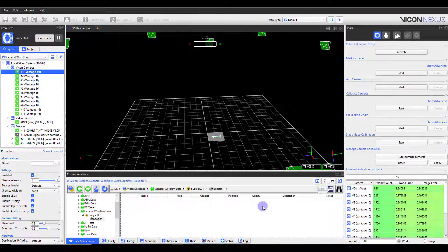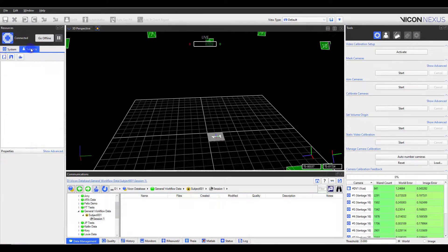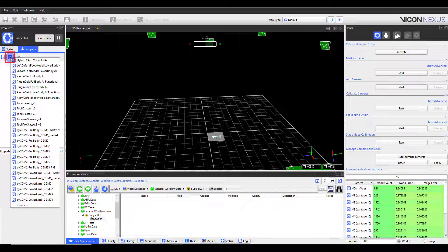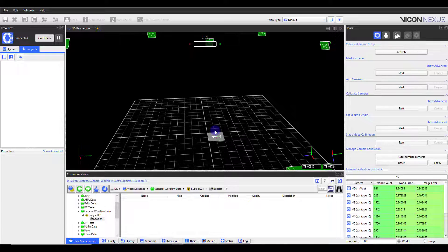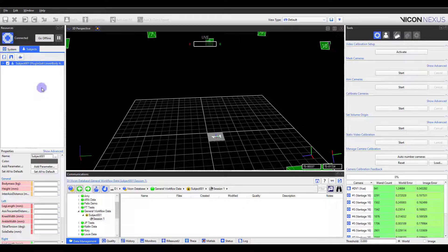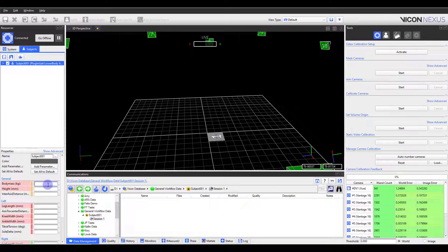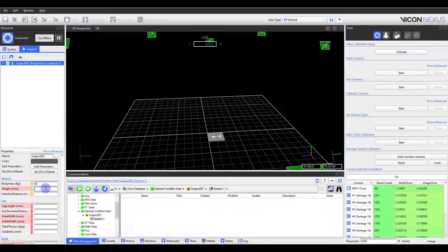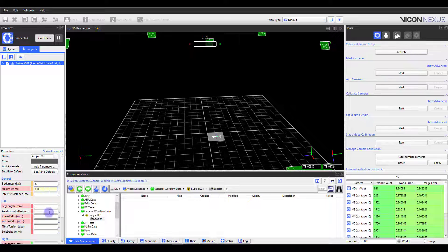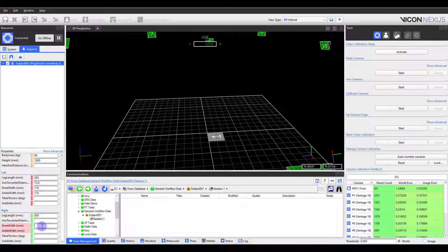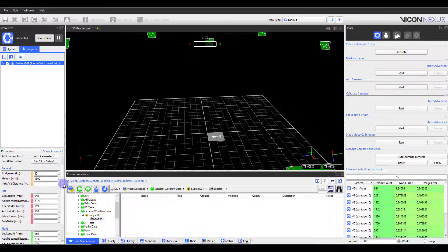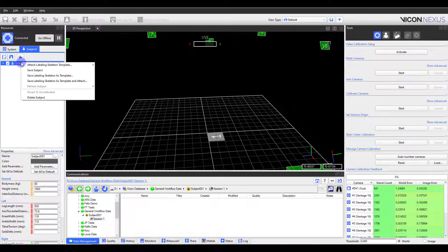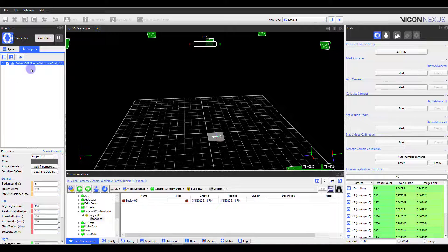Now that we have our session folder, we can add our subject and choose the labeling template we will be using. If you have taken subject measurements required for your model, you can enter them into the parameters now. Now is also a good time to save your subject.